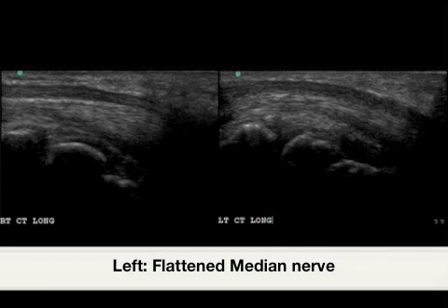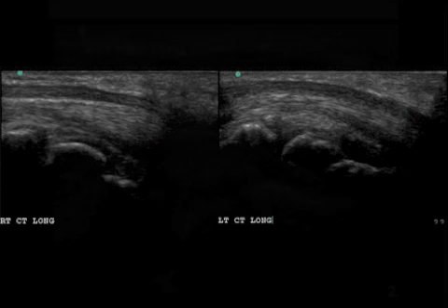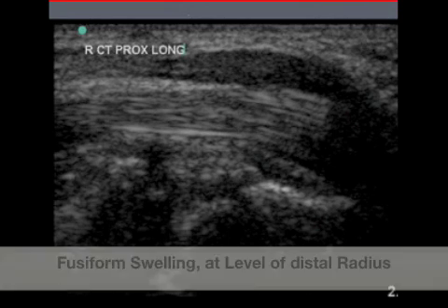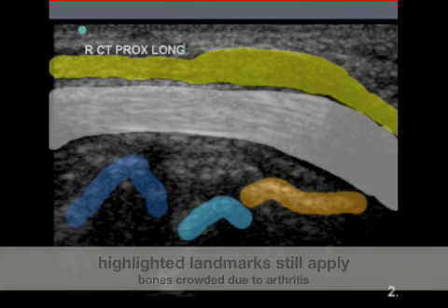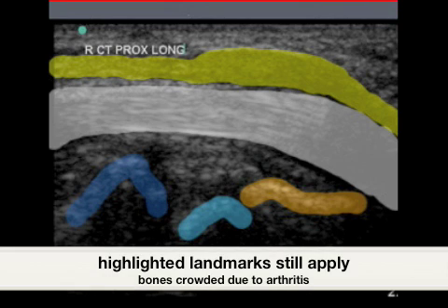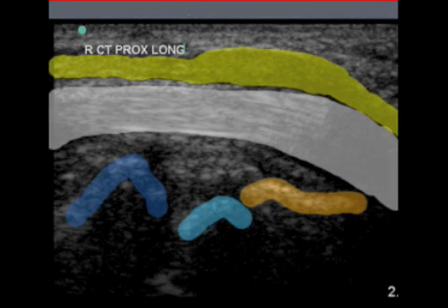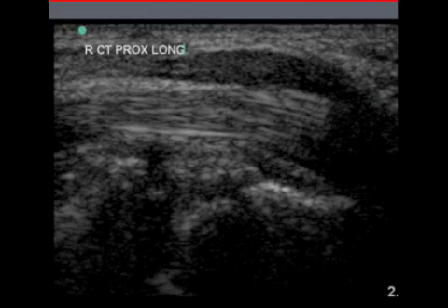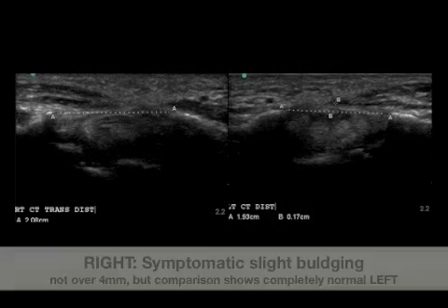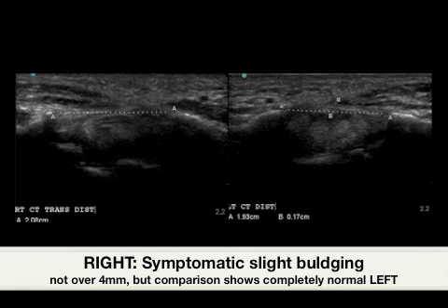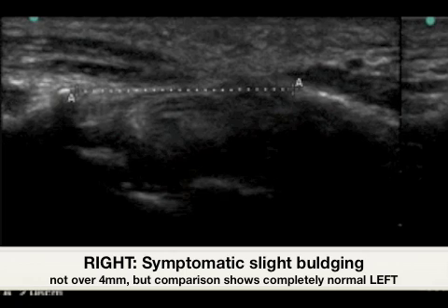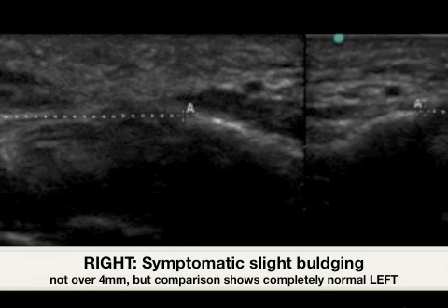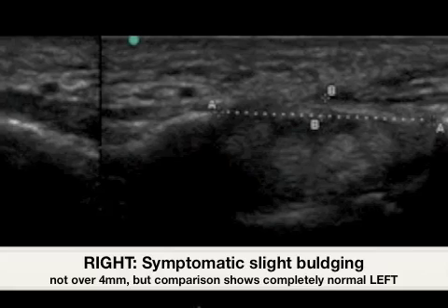The image on the left shows a characteristic flattening of the median nerve. In this image, there is a fusiform swelling or bulging just proximal to the carpal tunnel. Although not quite 4 millimeters, there is slight bulging on the symptomatic side in this wrist, where the asymptomatic side stays completely beneath the carpal tunnel level.